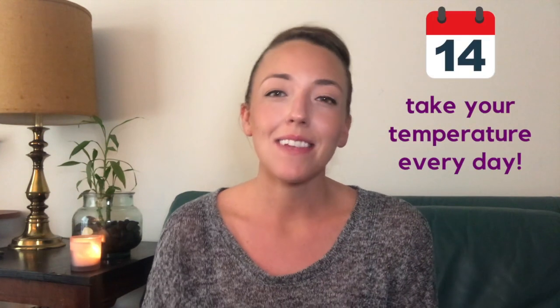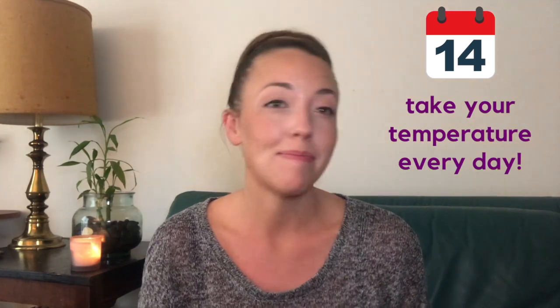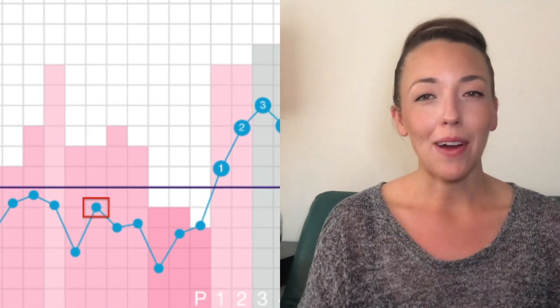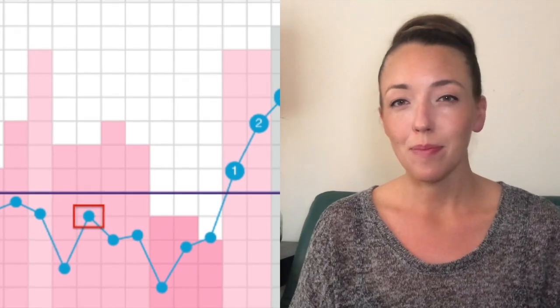Number 2 is that you need to take your temperature every single day. This isn't something that you can just do every now and then, or every other day, or just on Mondays and Fridays or whatever. You have to do it every day, because with fertility awareness, we observe a pattern in your temperature over the length of your cycle. We can't just look at one day of information and say, okay, I'm fertile or I'm not fertile. You can only do that when you are comparing one day to what has come before it, and you're observing that pattern. So it's super important that you do it every single day in order to get the information that you need.